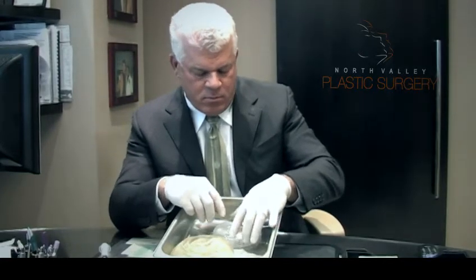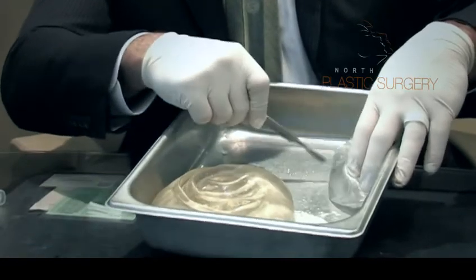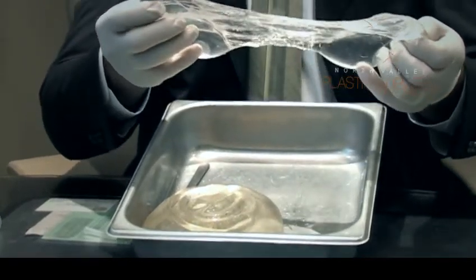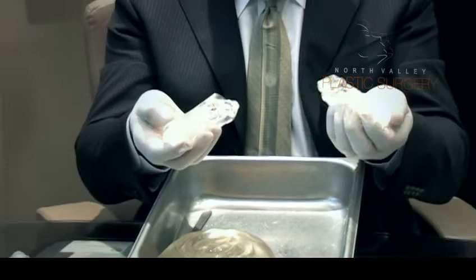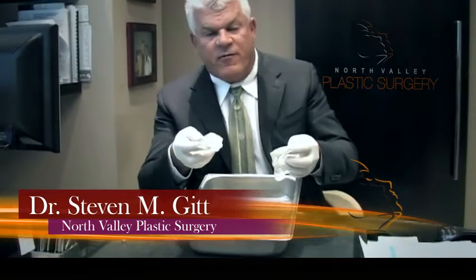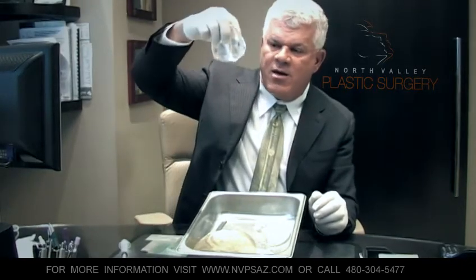So let's see what happens. Silicone gel has a much lesser tendency to want to stick to anything else. It is more cohesive. See? It tends to sit within the implant as opposed to the other implant where the silicone oozed out. The first generation silicone was in fact quite liquid. If you cut it, it just all came out. This is why these implants tend to hold their position much more effectively and have a lower incidence of leakage. It's very difficult to make one of these implants ooze its silicone completely out. It just won't go. And again, these are the implants that we're placing in 80% of our cosmetic breast augmentation procedures today.